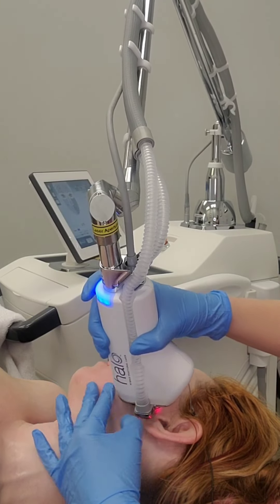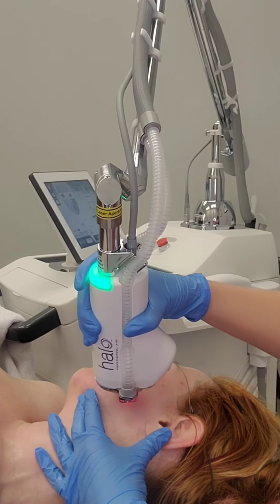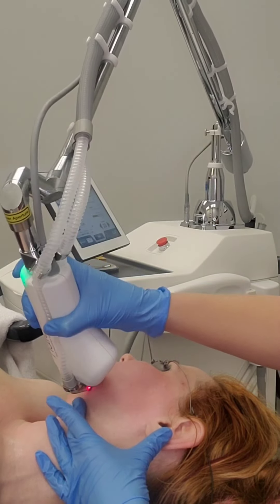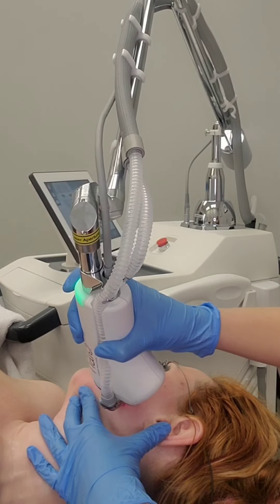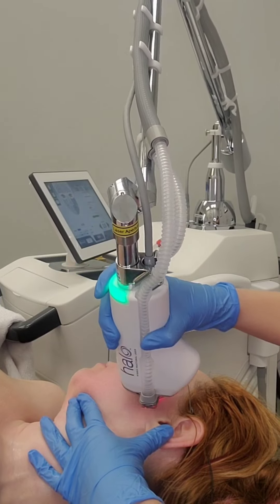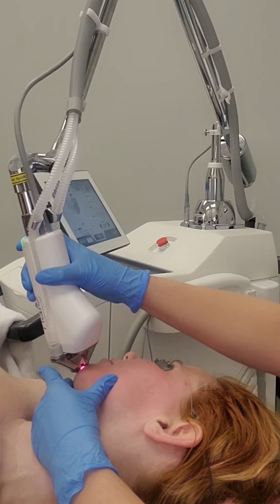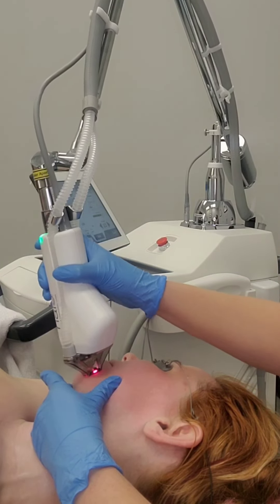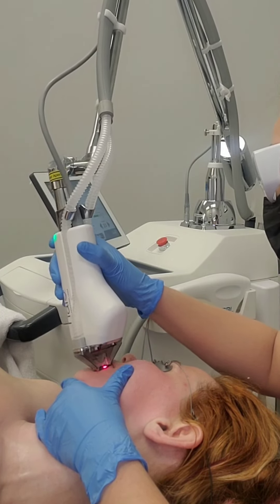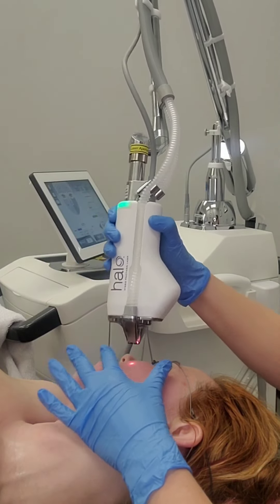You get really comfortable with this procedure quickly. The density settings and the tubing were intimidating to me at first because I'm used to old-school micro laser resurfacing, and I've been doing BBL for over five years. But this is so easy once you figure out that you just have to take your time — it's not a race. You get your time down, figure out the right settings, and know what to prepare your patient for.